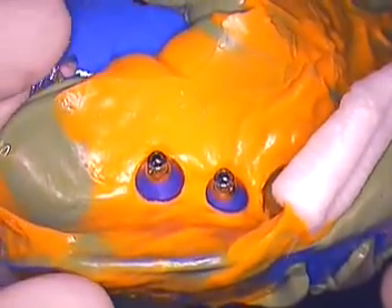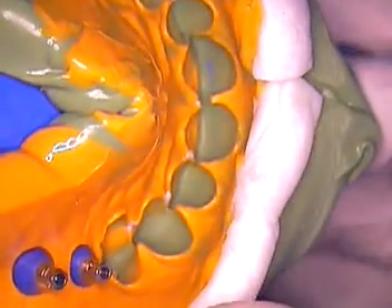We do have to adjust the occlusion at times, but for contacts, tissue adaptation, and preventing any seating issues that are questionable — go with an open tray and your troubles will be over.